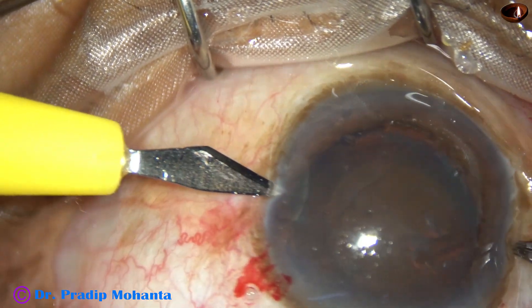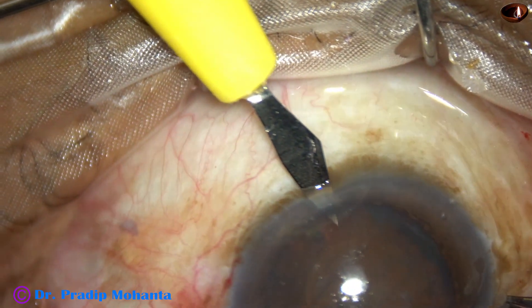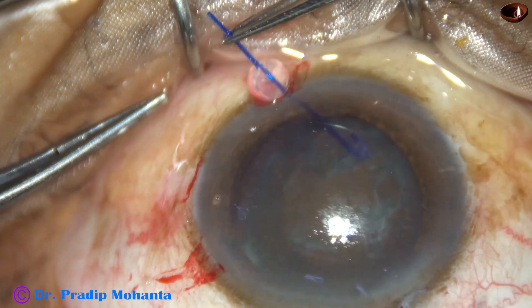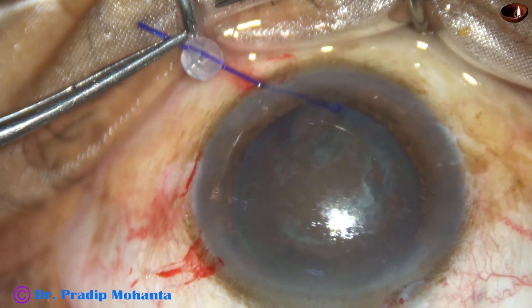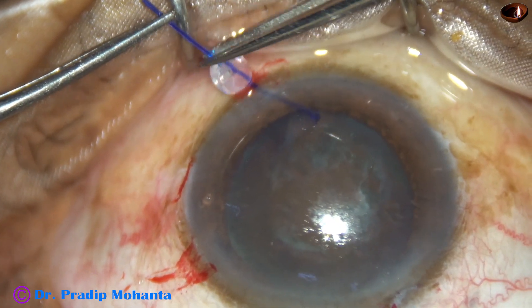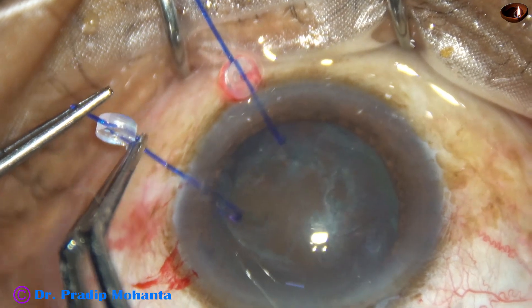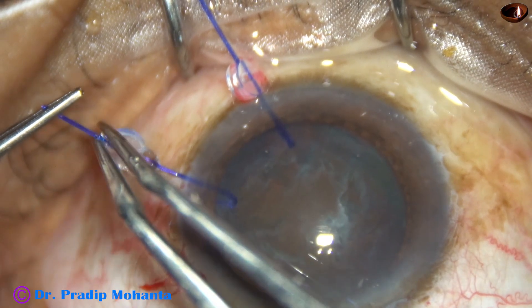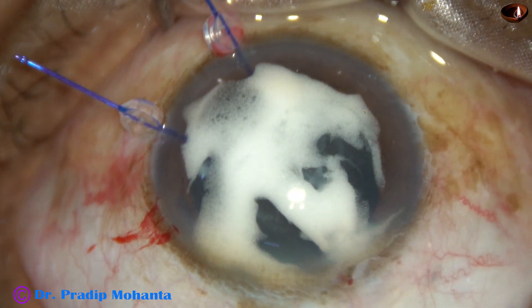Two small stab incisions are made at 3:30 o'clock and 5 o'clock to apply two iris hooks. The capsular hooks will not go in — there is no space — and I had to struggle a lot to apply these two iris hooks to hook the capsular margin. This will give vertical support; the capsular tension ring has given horizontal support.